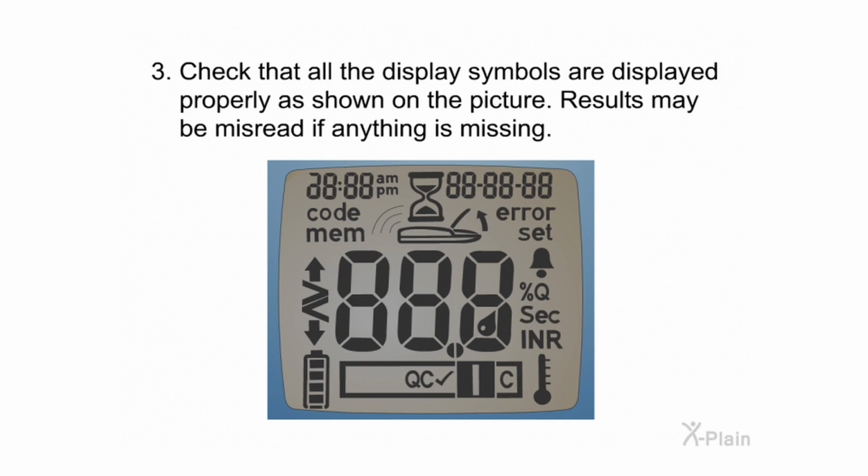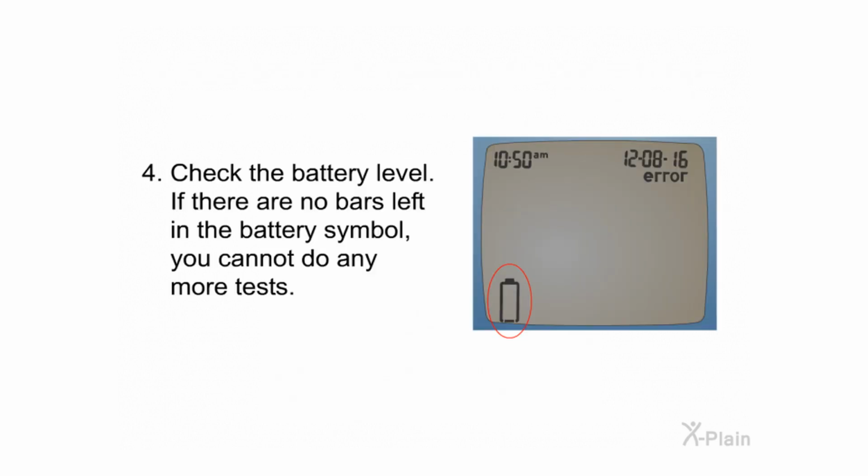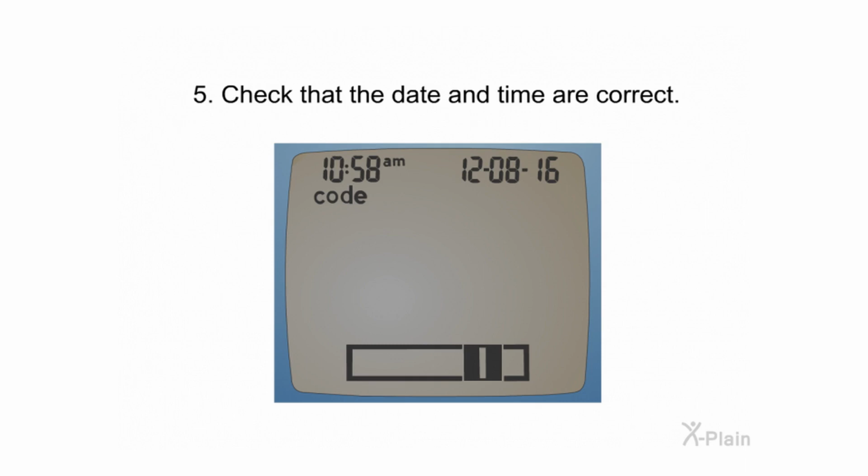3. Check that all the display symbols are displayed properly as shown on the picture. Results may be misread if anything is missing. 4. Check the battery level. If there are no bars left in the battery symbol, you cannot do any more tests. 5. Check that the date and time are correct.